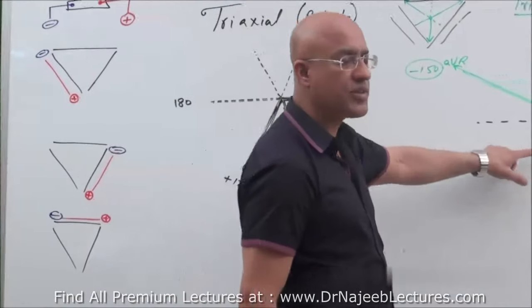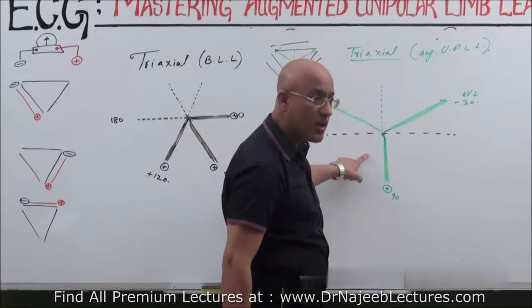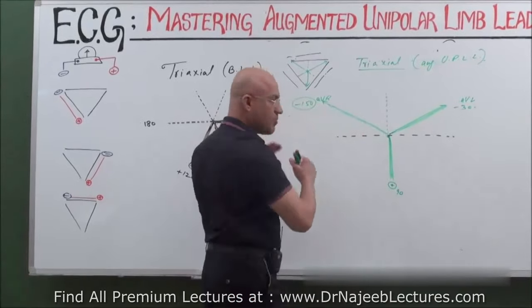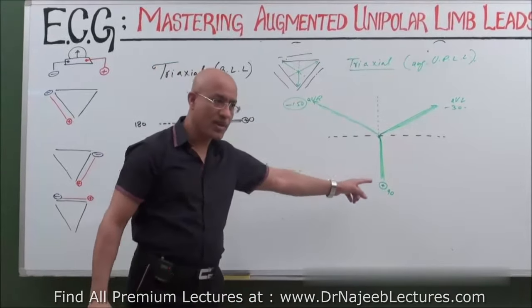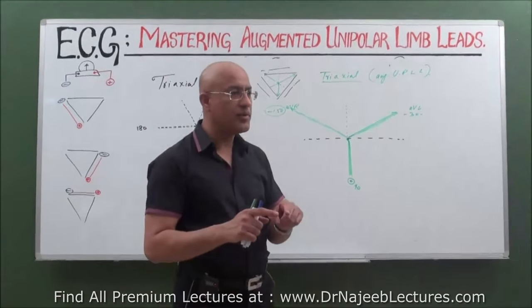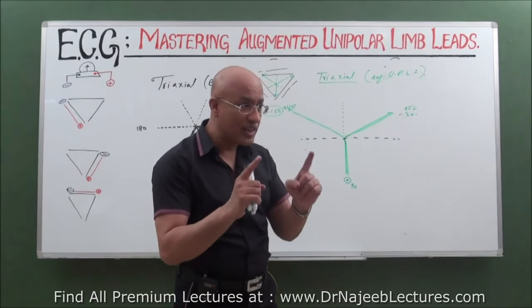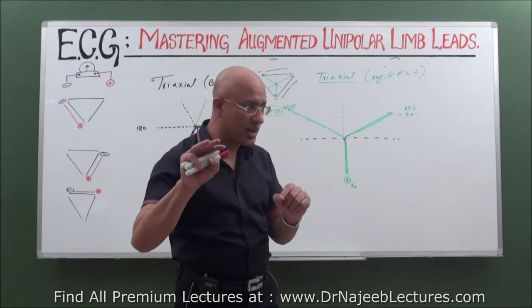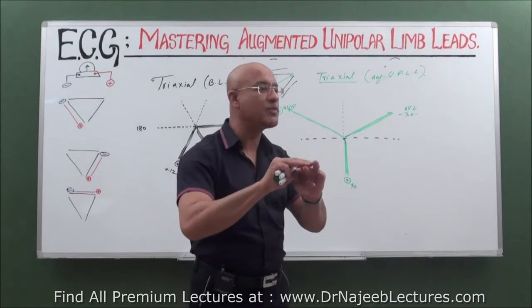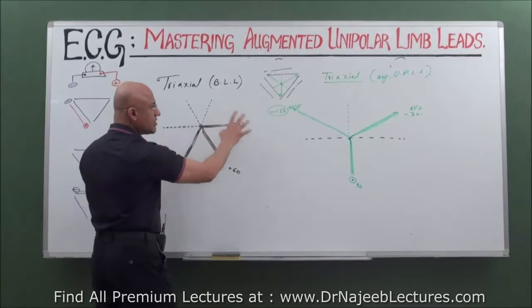That diagram is representing the triaxial orientation of augmented unipolar limb leads. And when you combine the diagram of both, then you come to know the orientation of the six limb leads, three bipolar leads and three augmented unipolar leads, relative to each other. So let's combine these two diagrams. Let's combine this and that diagram.